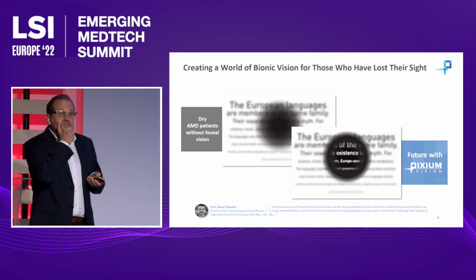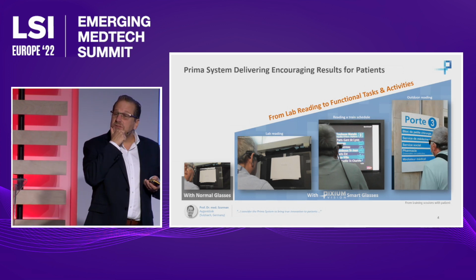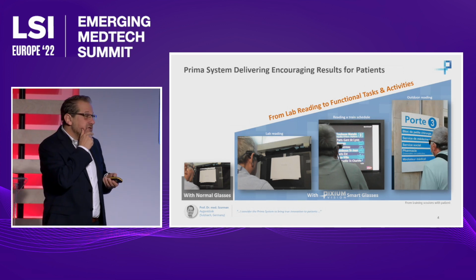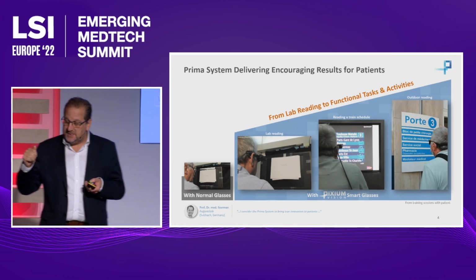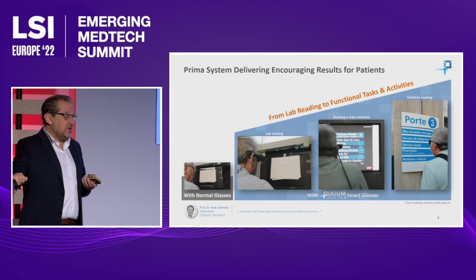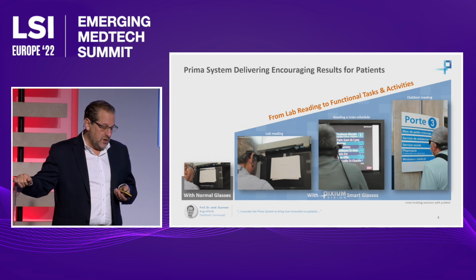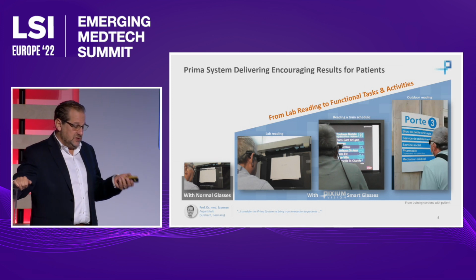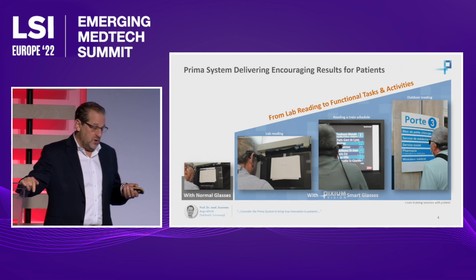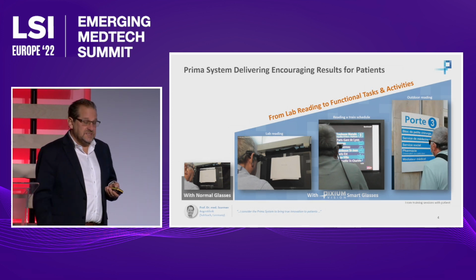So what I wanted to do is just show you a real life experience here of a patient that 12 months post-implantation was undergoing a reading test, where we don't allow them to use our system, and they're just simply using their corrective lenses that they wear for their peripheral vision enhancement. We ask them if they can recognize the letters or a word on a page. And then we allow them to use our system. We change the page with a different word, and we see if they can recognize those letters and state the word. So here you can see the word elephant.